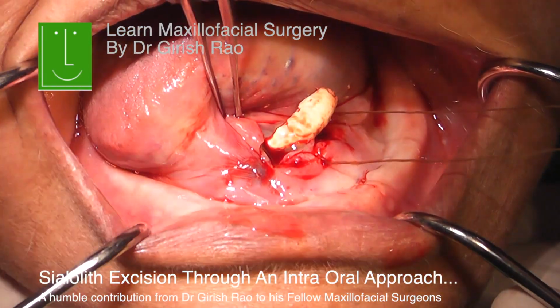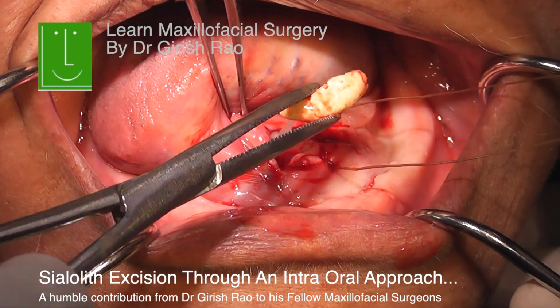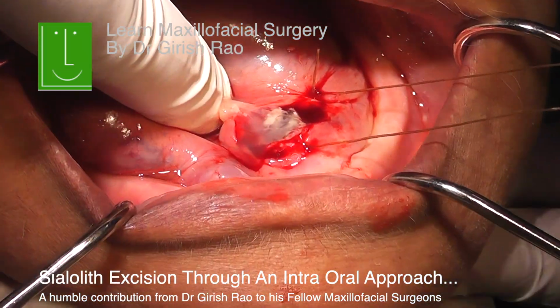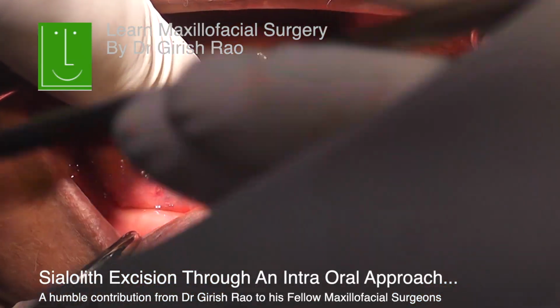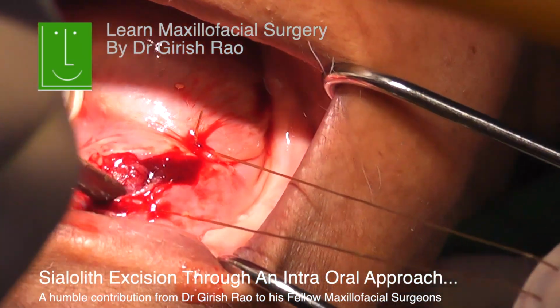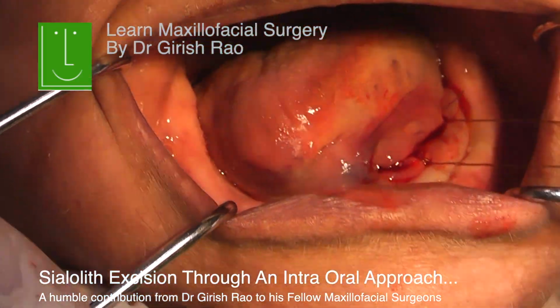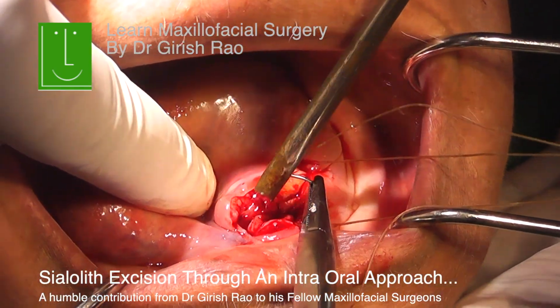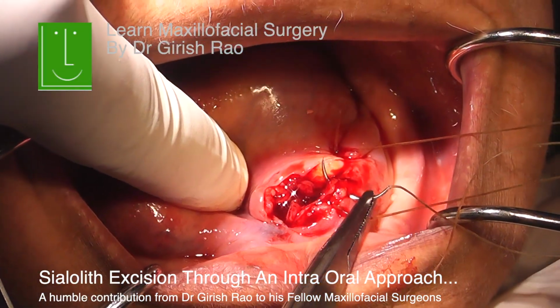This is the key. The moment you make a nick, you can see the white structure. It looks almost like a tooth. That is the shape of the duct it would have taken, and that's the thick mucus which is coming out when you milk the submandibular salivary gland. It is important to remember that many times there could be multiple stones, so when you palpate and put some pressure on, you can milk all these things out.